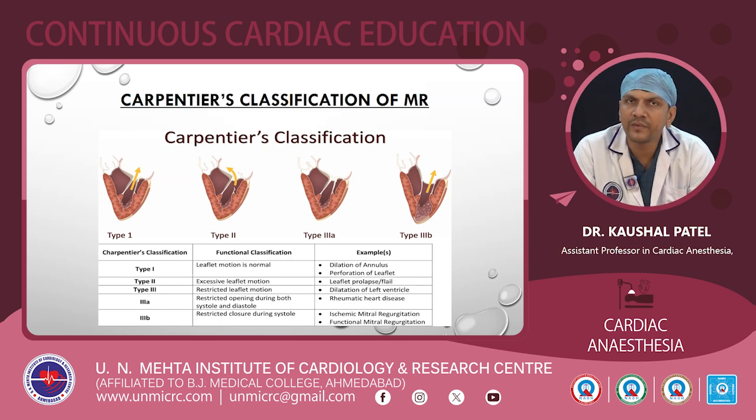3A is restricted opening during both systole and diastole. An example is rheumatic heart disease, because in rheumatic heart disease annular calcification and leaflet calcification occur. So there is restricted mobility in both systole and diastole. And type 3B is restricted closure during systole.